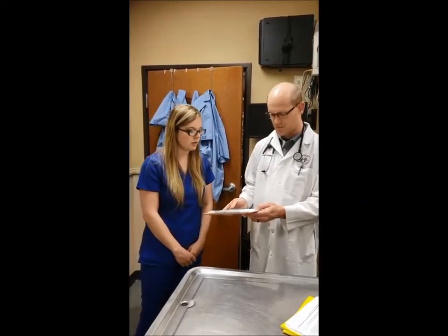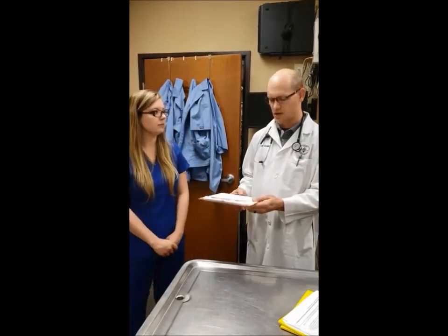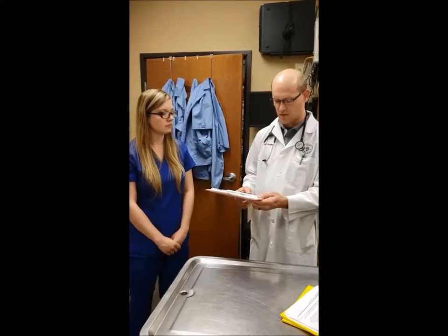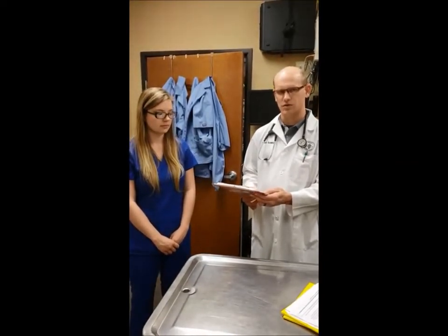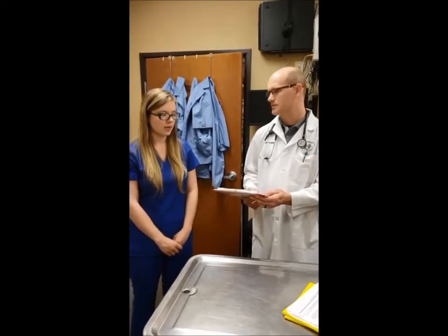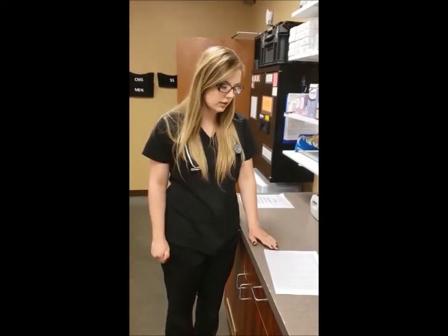Great, and then also we're going to induce anesthesia with propofol for this patient. That's right. So in order to get him intubated and get him on isoflurane gas, which is his main anesthetic, we'll use propofol to induce anesthesia. Okay, sounds good.